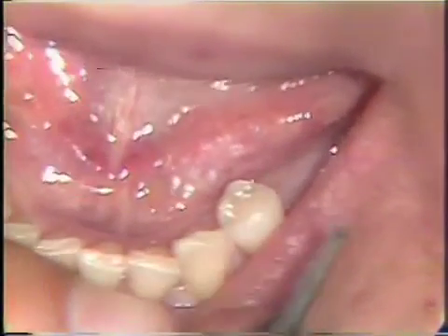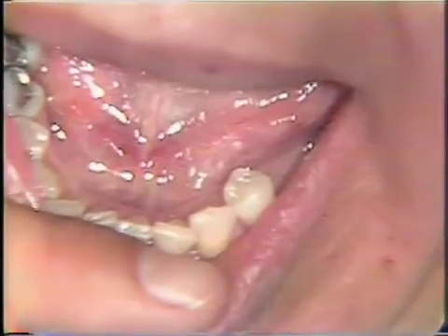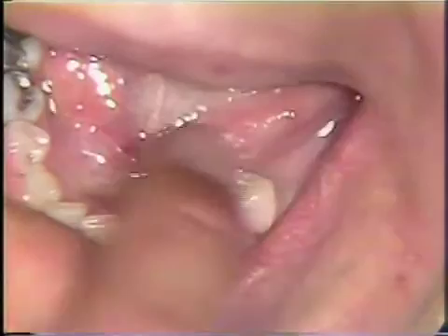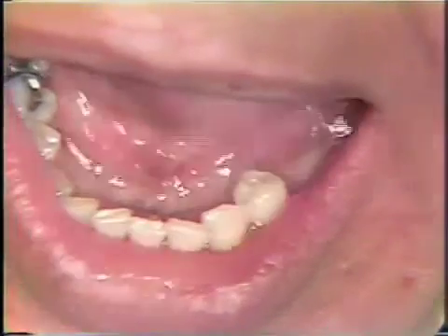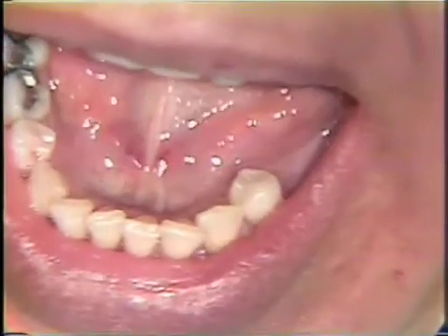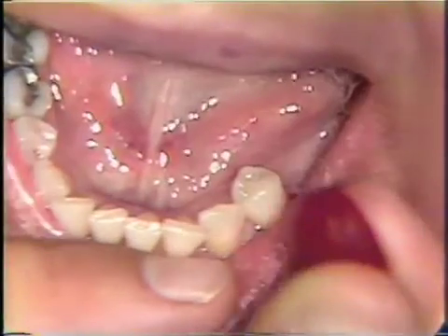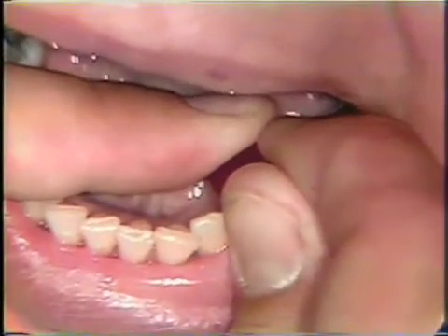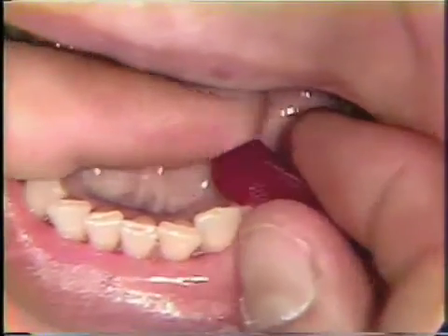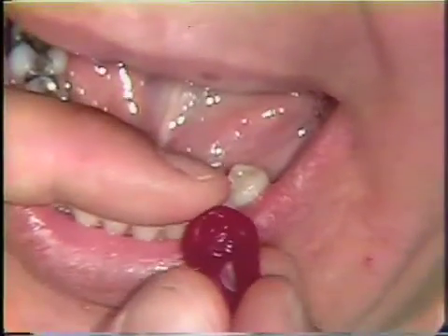When you think you are coming close and you want to check the depth of the rest, this can be done with red wax. We're going to check the depth of the rest to this point. Have the patient lubricate that area with their tongue so that the red wax will not stick to the tooth. Then the red utility wax is merely used as an indirect indicator as to whether the rest is deep enough or not.